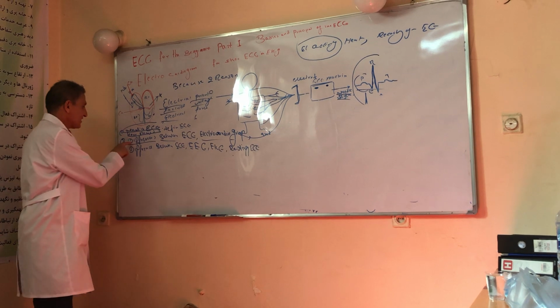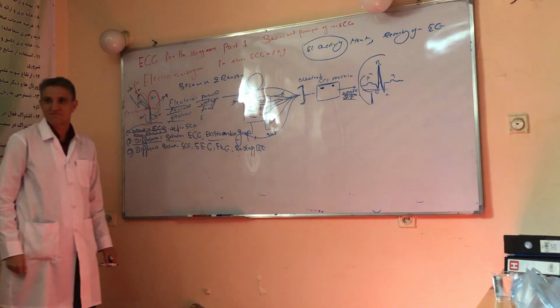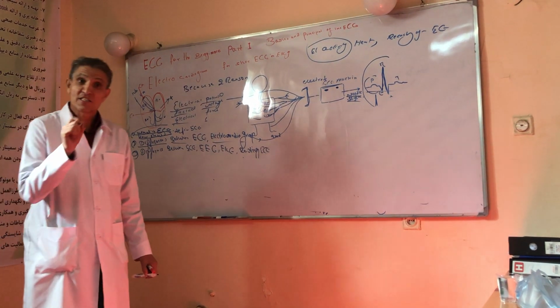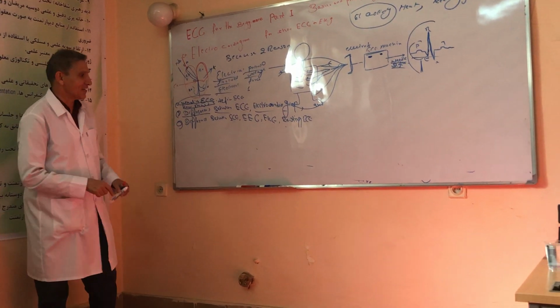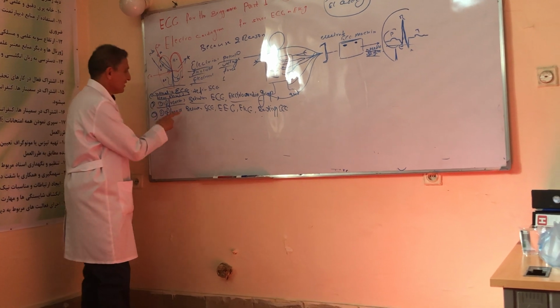The second matter is differences between electrocardiogram and ECG graph. I think we have included this matter in our bedside discussions. And now again, we'll discuss these three terms.